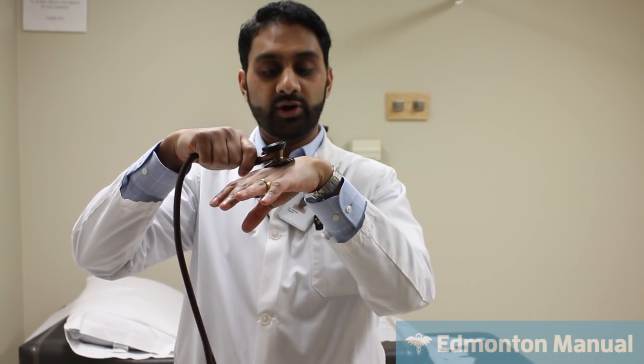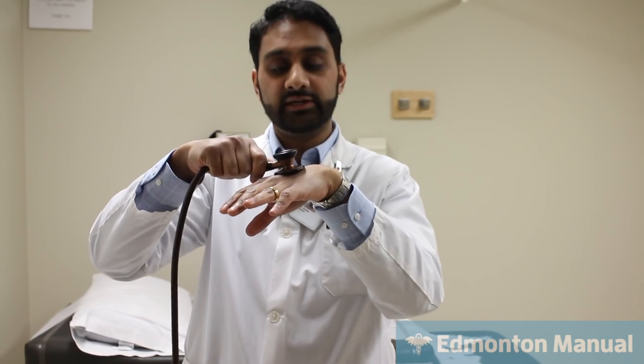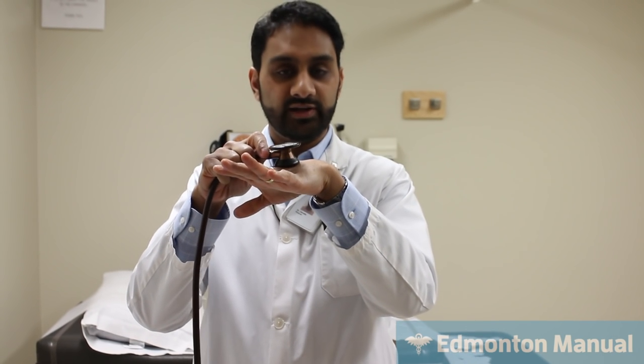So here we have again the adult side, which is the diaphragm, but instead of a pediatric side, this stethoscope has been converted to a bell. In this case, you would still take the regular diaphragm side, push down a little hard so that it's a diaphragm, and if you wanted to, you can modulate the pressure and go lighter so that it acts like a bell. Or you can switch it over like you would with the traditional stethoscope, and again, you just have to make a very light seal for this to act like a bell.